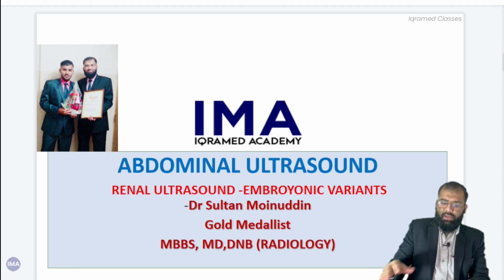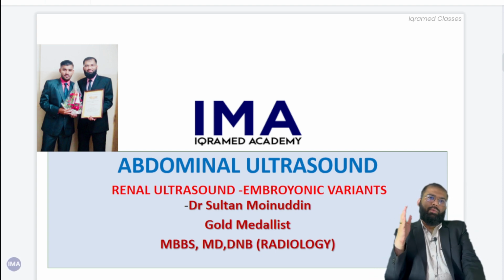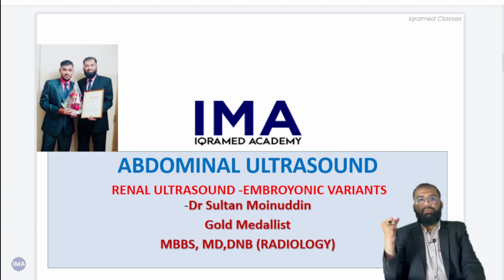Presently we are at a status where we know where kidneys are located, and we know how the normal kidneys look like. Now, in this lecture, we would see the various embryological variants or normal variants of kidney as well as abnormal variants, how kidney can be.